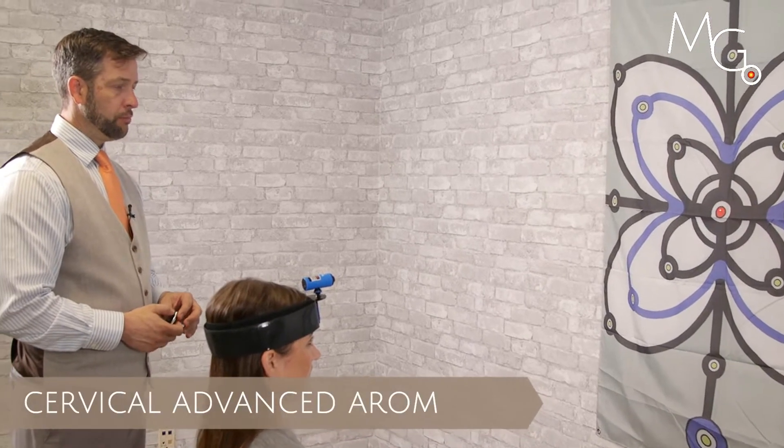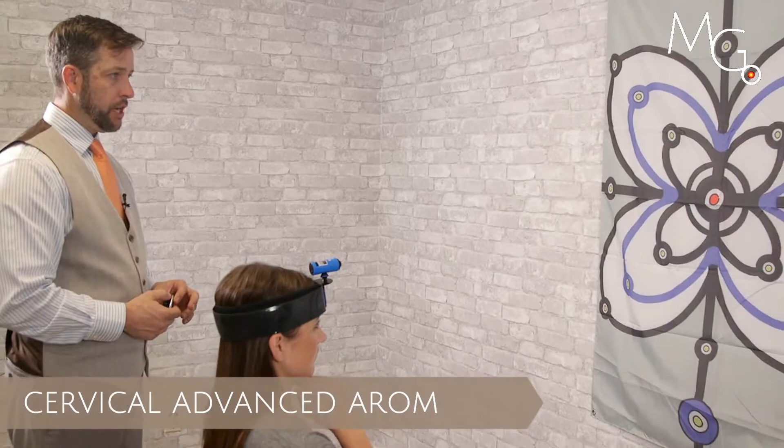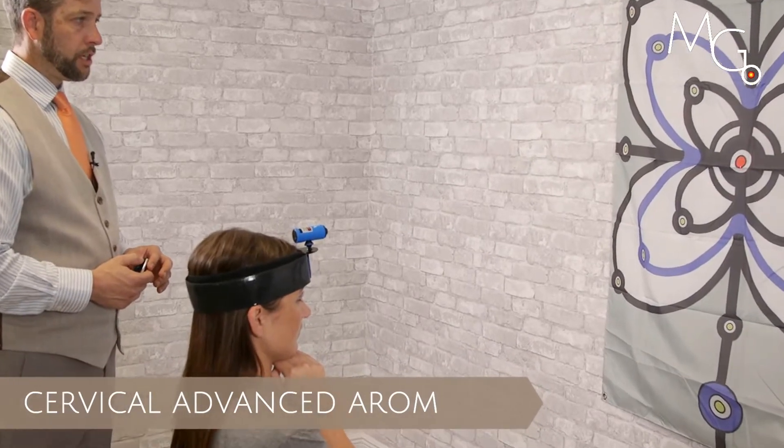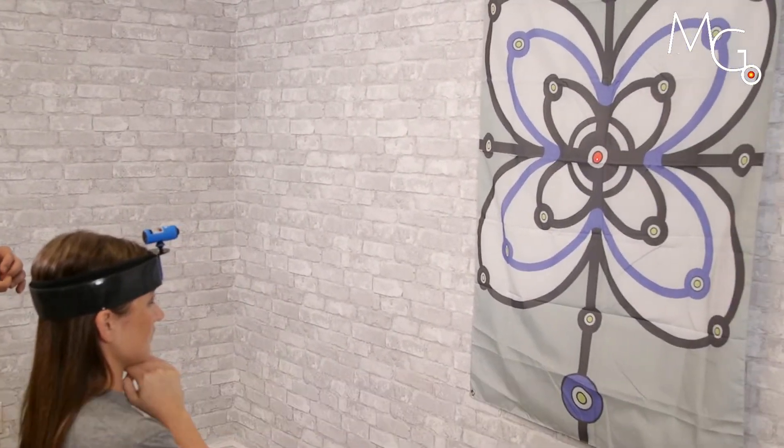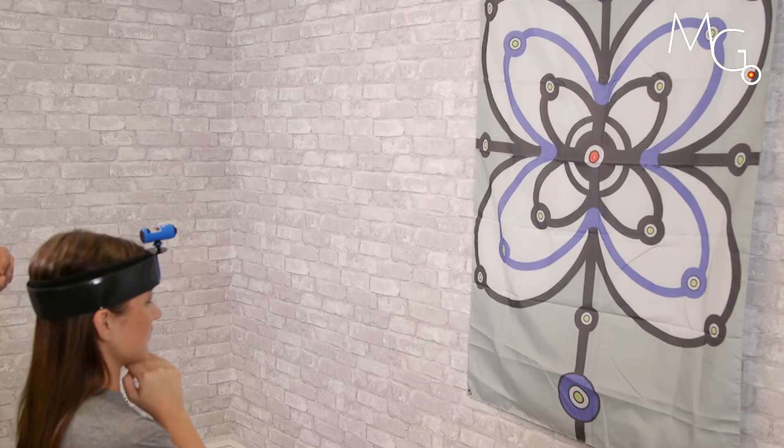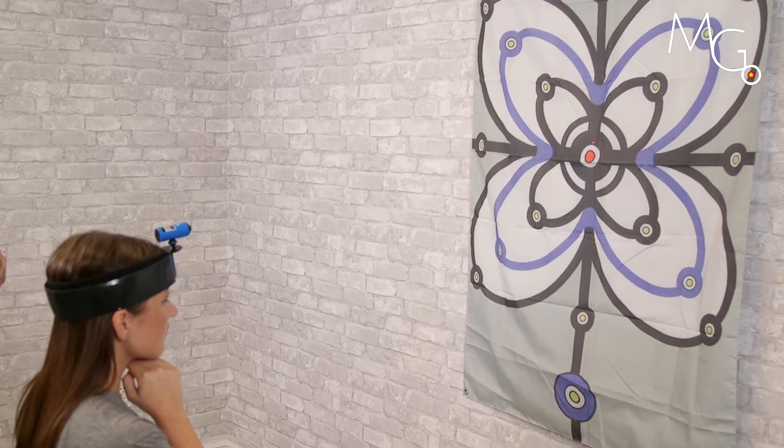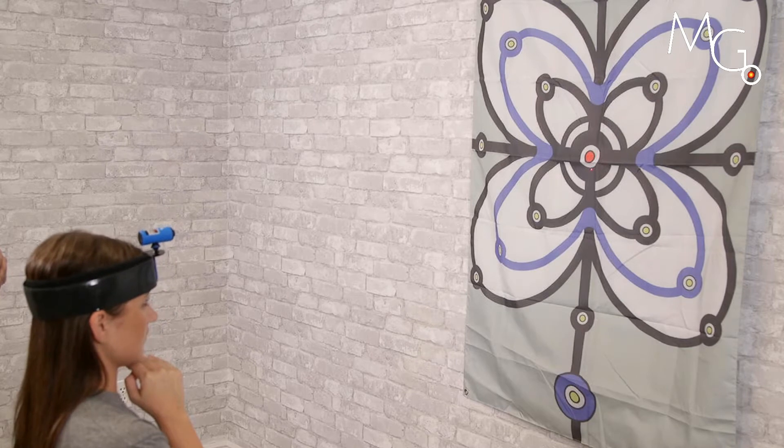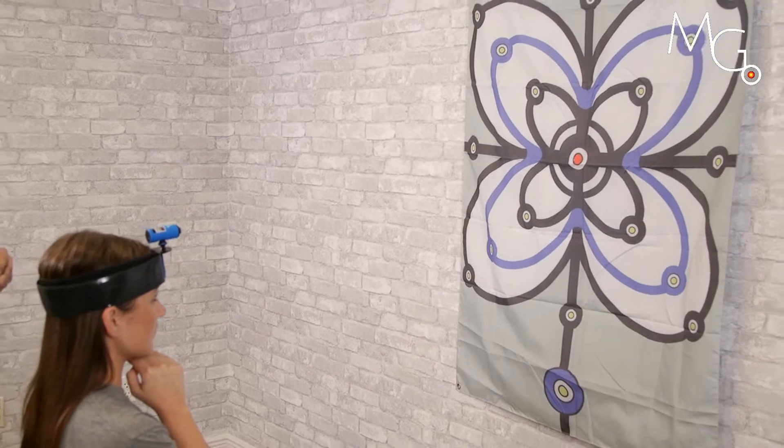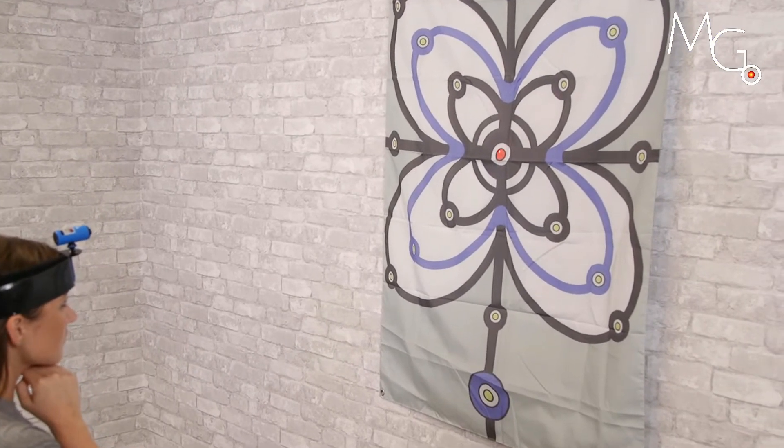For protraction and retraction movements of the head and neck, have the patient center the laser on a target. Cue them to keep the laser inside that target and move their head forward toward the wall, then back and away, forward and back.